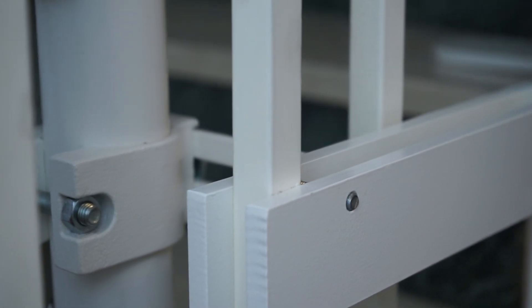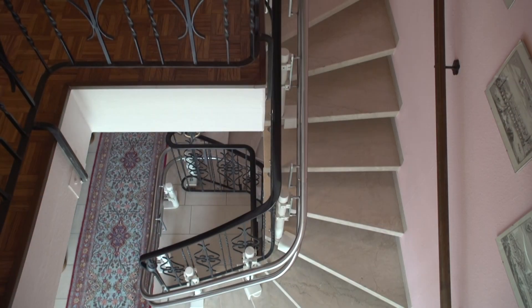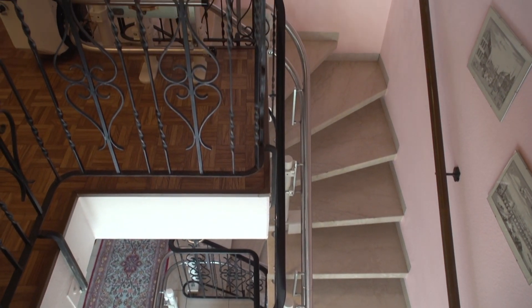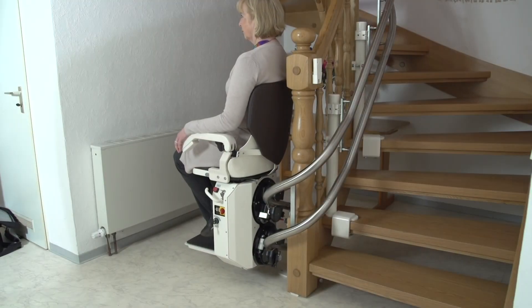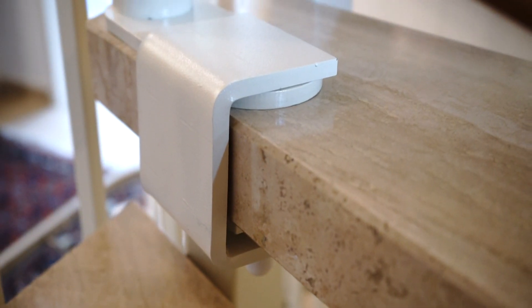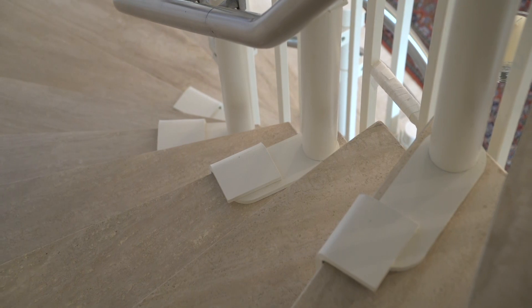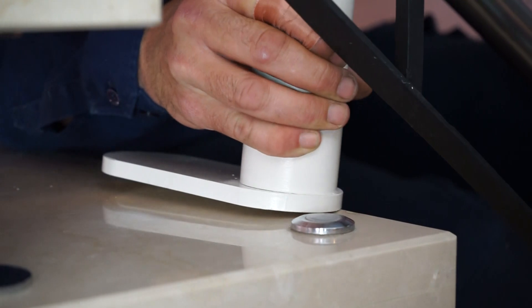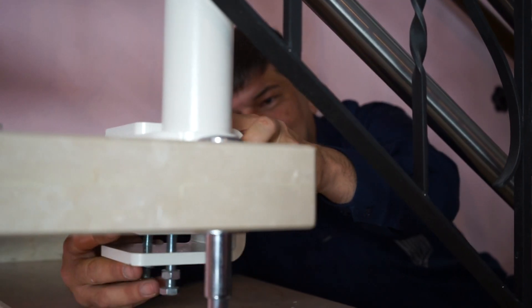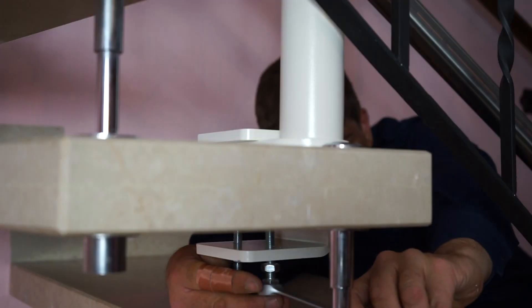Hero Lift mounting option one: mounting clamps. Mounting clamps offer the best solution for staircases with floating steps made of marble, granite, or wood. Sturdy clamps are used to secure the guide rail supports to the staircase. These simply slide onto the steps and are then tightened so that they offer the same stability as bolted supports.